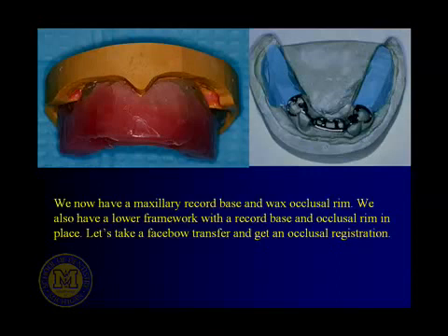Whether they're done ahead of time or whether you try the framework in the patient's mouth, make sure the framework fits, and then go ahead and fabricate your temporary bases / occlusal rims. So you try these things in the patient's mouth. We've got things going in. We're going to take a face bow.